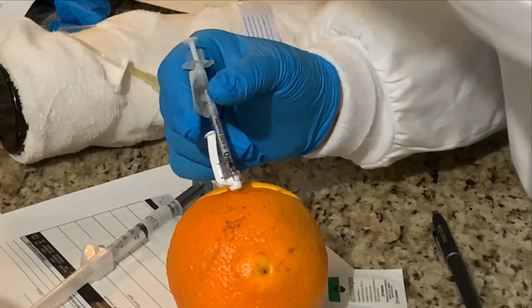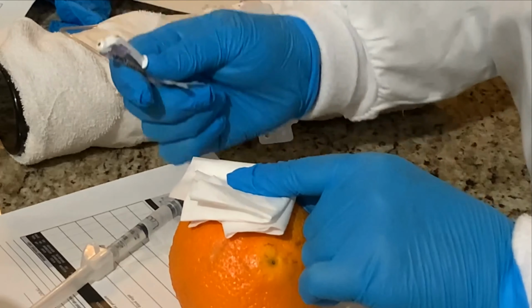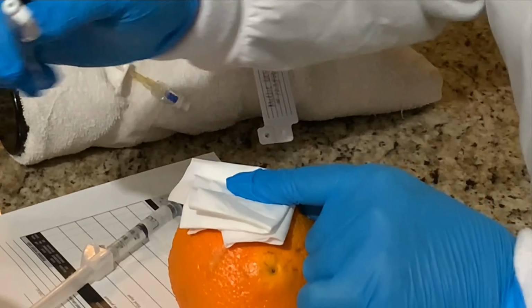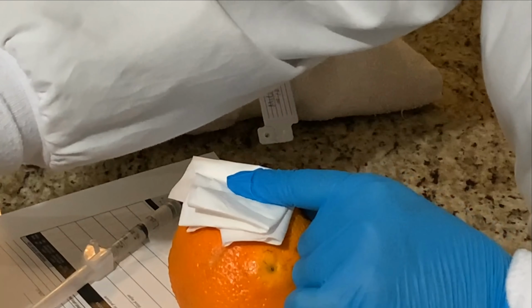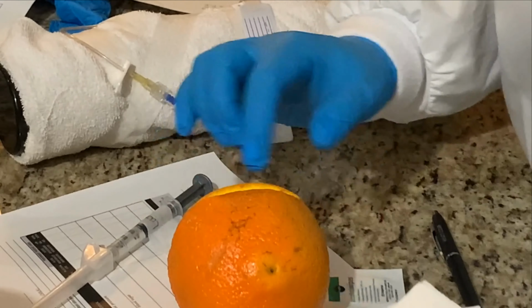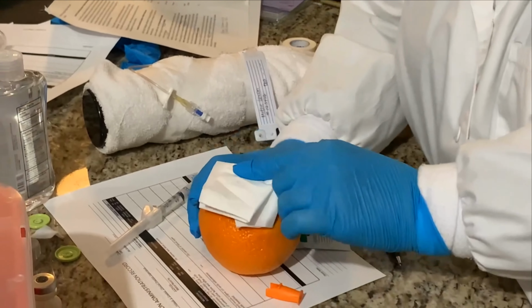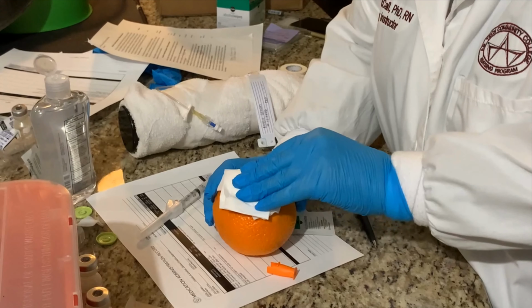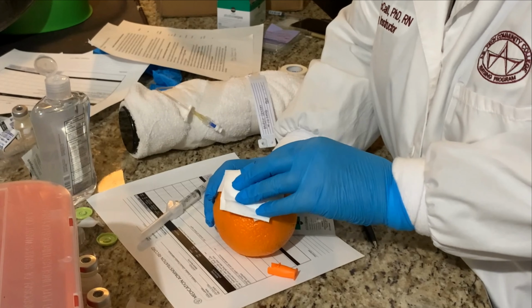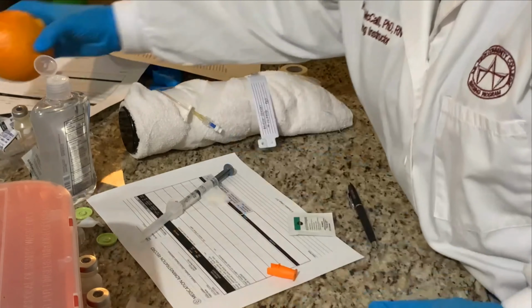And I'm going to remove it. I just apply gentle pressure with my gauze pad. Apply my safety. Put this in my needle box. And I'm inspecting the site. There's no bleeding, no bruising. And that's why we apply gentle pressure. Don't rub, just apply gentle pressure right after you take the needle out, because if you don't, you'll see a lot of bruising. Okay.